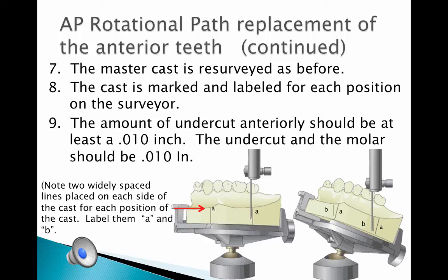The undercut on the molars will be 0.01 inch, though I've also seen a 0.02 in an article, but this is usually used for frameworks that are cast in gold and where the arm can be made to flex because it is very long. A design is drawn on the cast, a prescription prepared, and the case is ready to send to the laboratory.